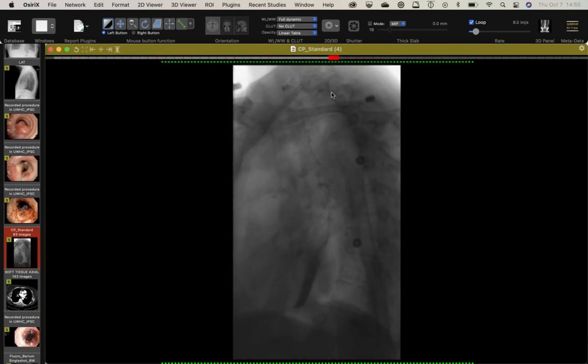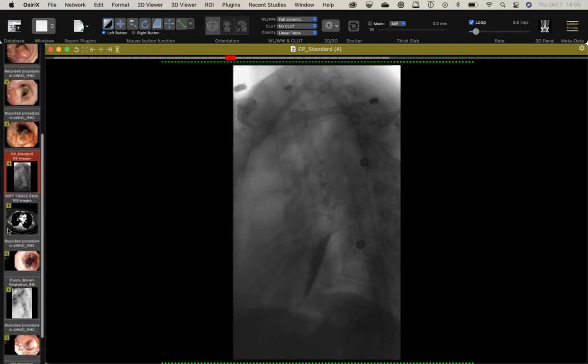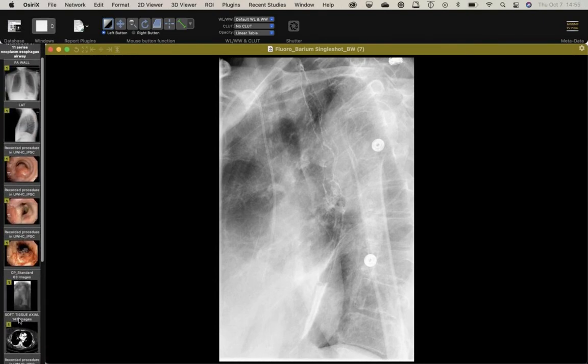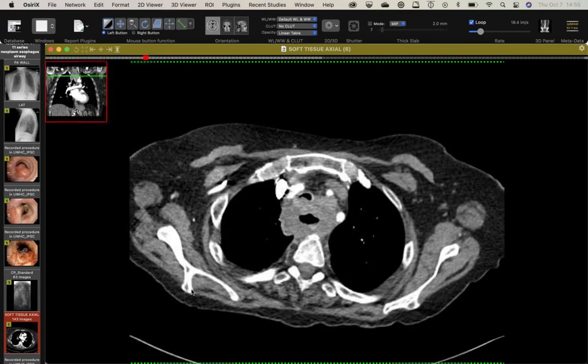I also have a nice esophagram, pre-stent, but you can see that you just got this really ugly looking esophagus. Go back up here. You can just see the really irregular contours there. So this is just an ugly tumor. Here's another image there, just showing that real tight lesion there, and then just this marked irregularity. So a really bad squame with an esophageal fistula and direct invasion.